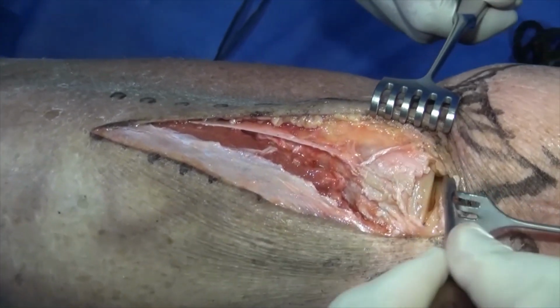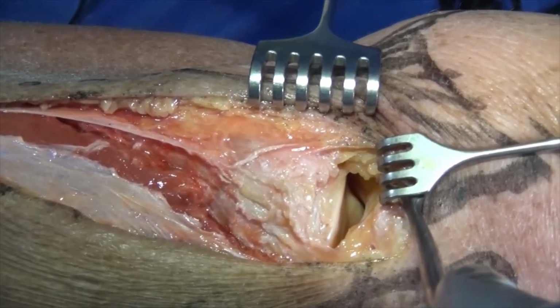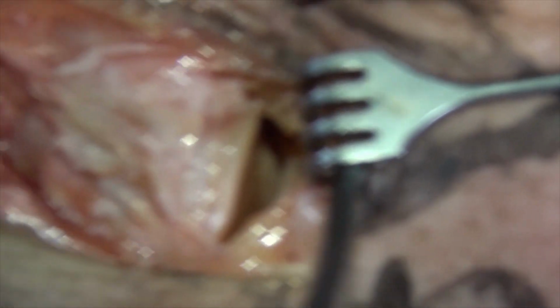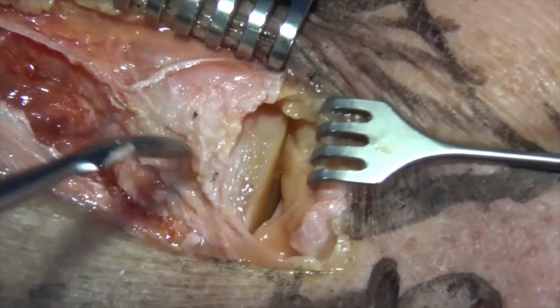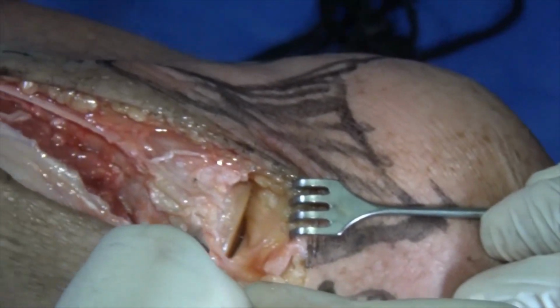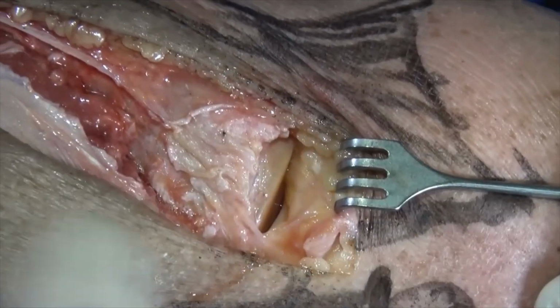you a pretty good view inside the joint, and you can see the anterior 3/4 of the joint from here to get your reduction. And usually you have a fracture of the lateral head coming down here. You can move the fragment out like a window, go inside, reduce under direct vision, put this back like a trapdoor, and fix it with K-wires.